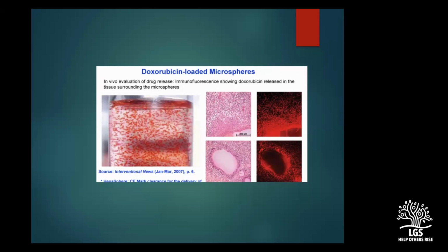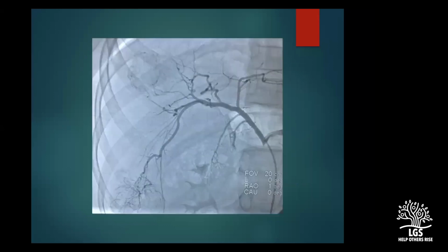So we can actually differentiate whether there is a tumor inside the liver or not by injecting lipiodol rather than going in for DEB-TACE or the drug-eluting beads. This is a young boy who had 2 tumors. You can see subtle tumor blush, one at the top end of the liver and one at the bottom end. This was in segment 6, and I think the other one was in segment 7 or 8.